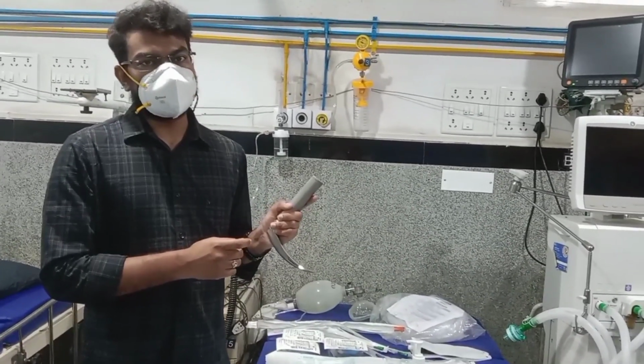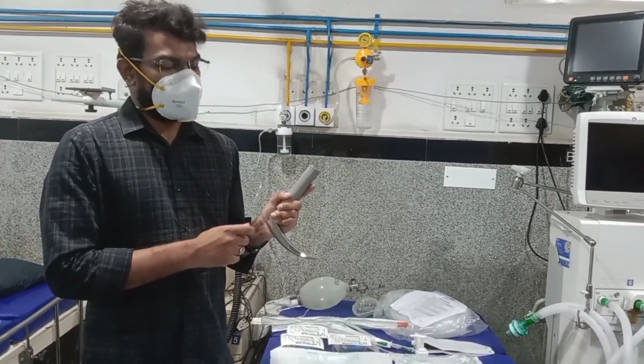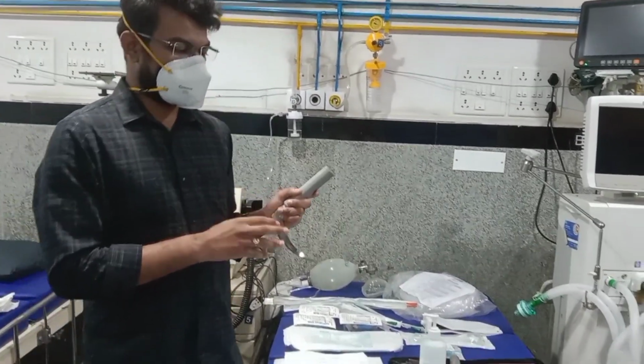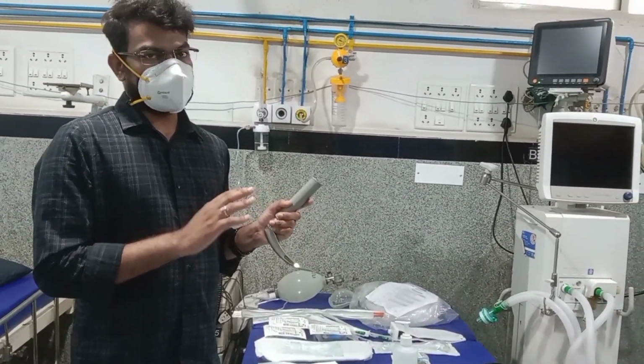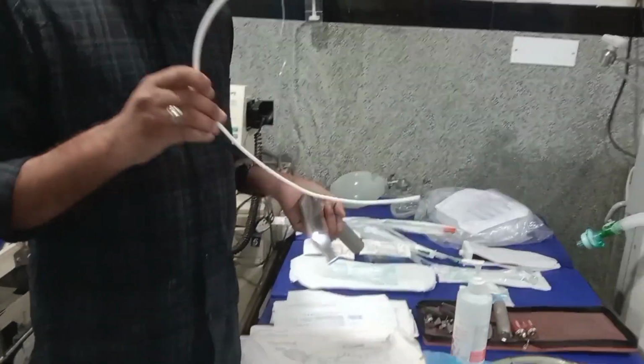Inflow and outflow of air can be seen through the larynx and the trachea. We shouldn't put the bougie or anything without visualizing the trachea. Once you visualize the trachea, we put the bougie into the trachea.